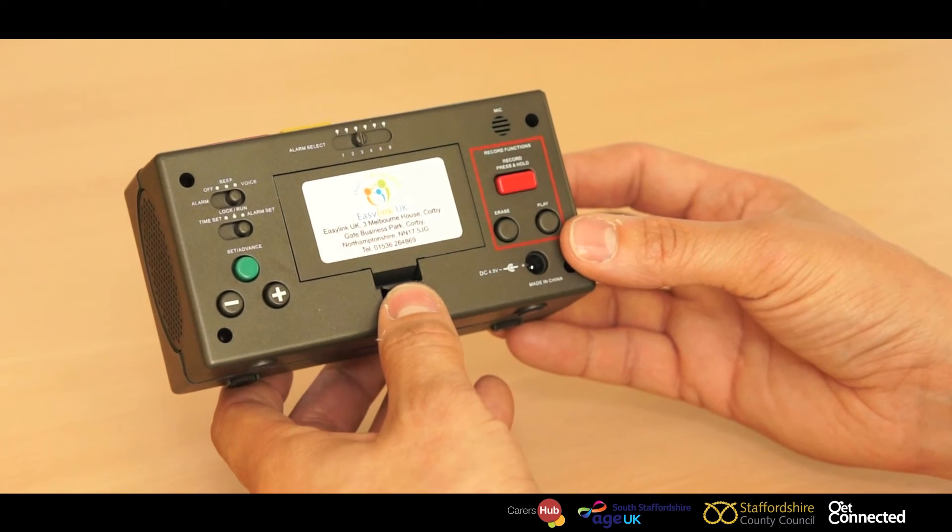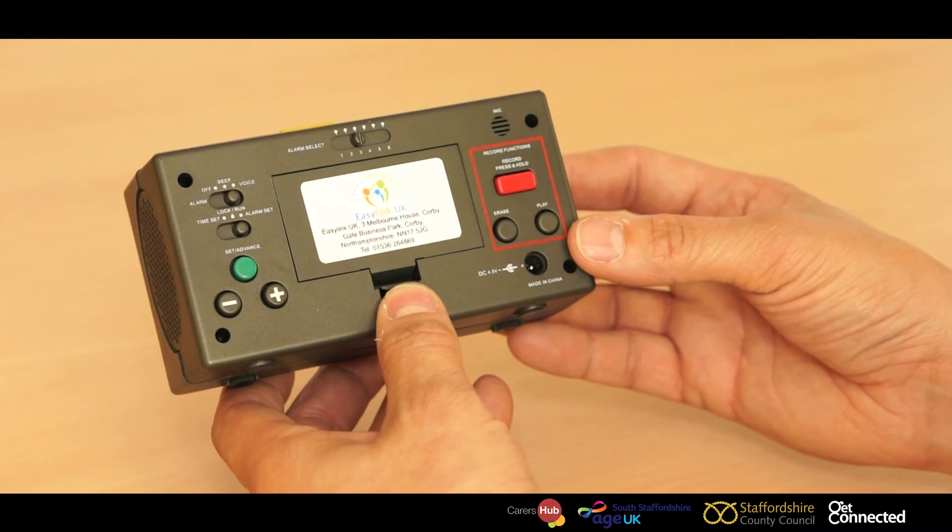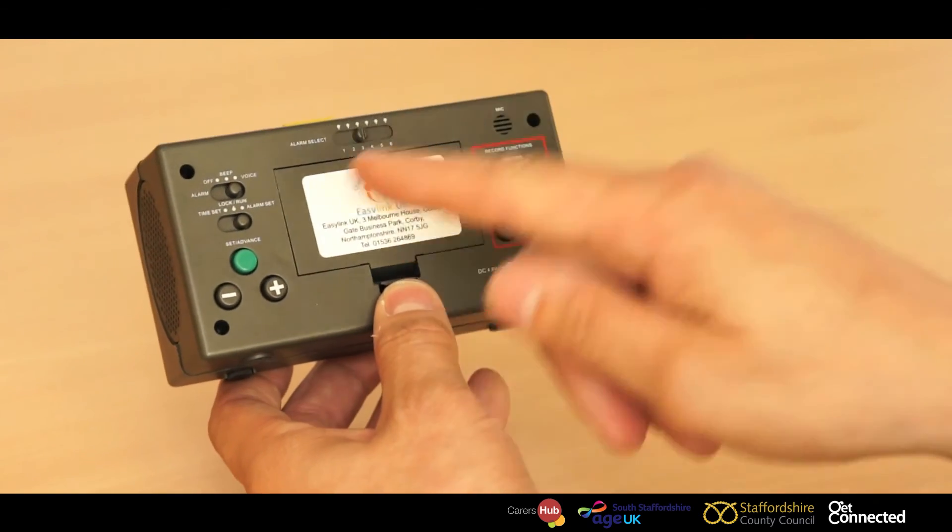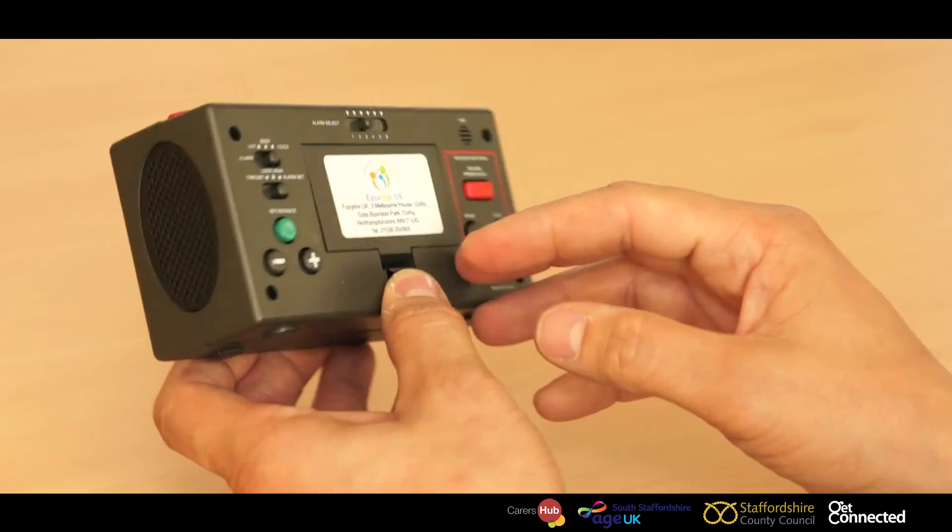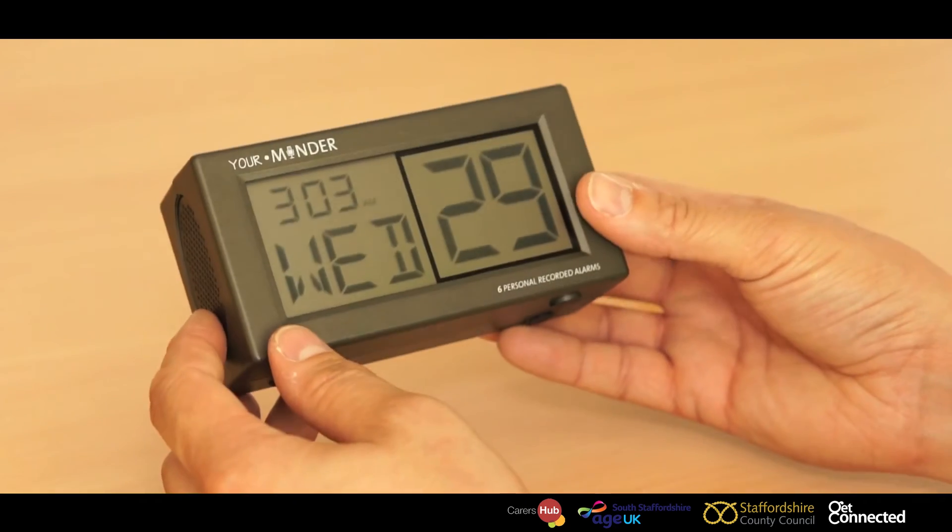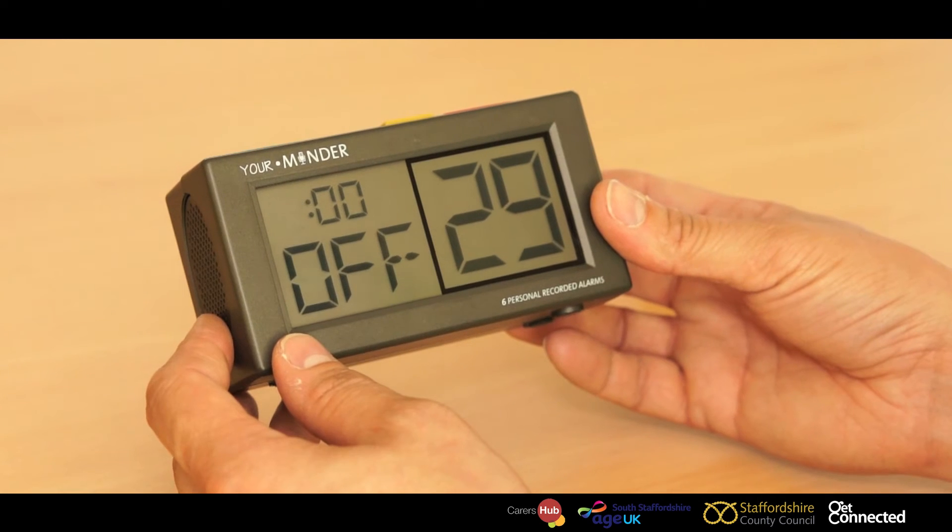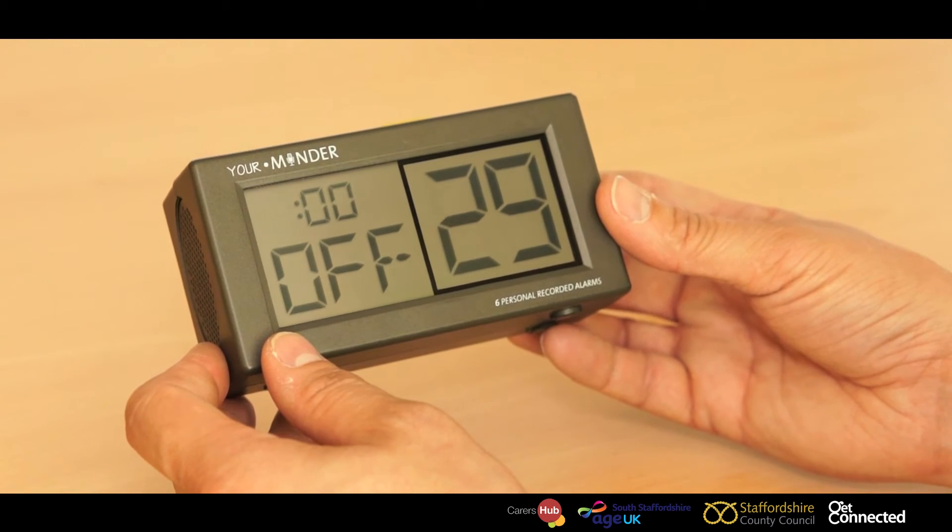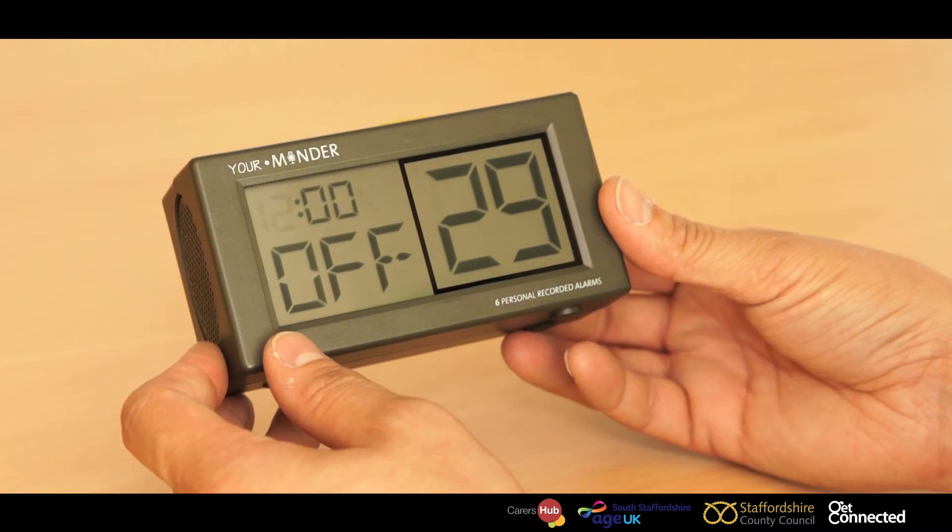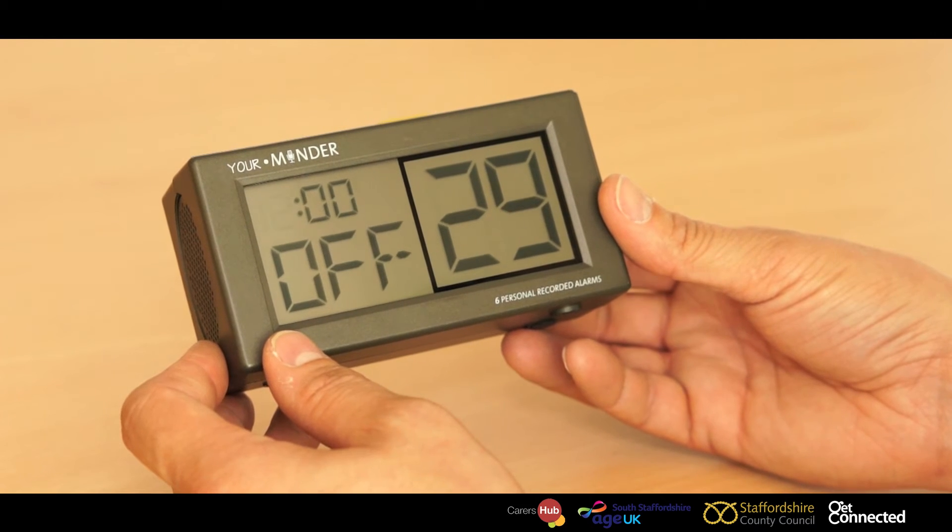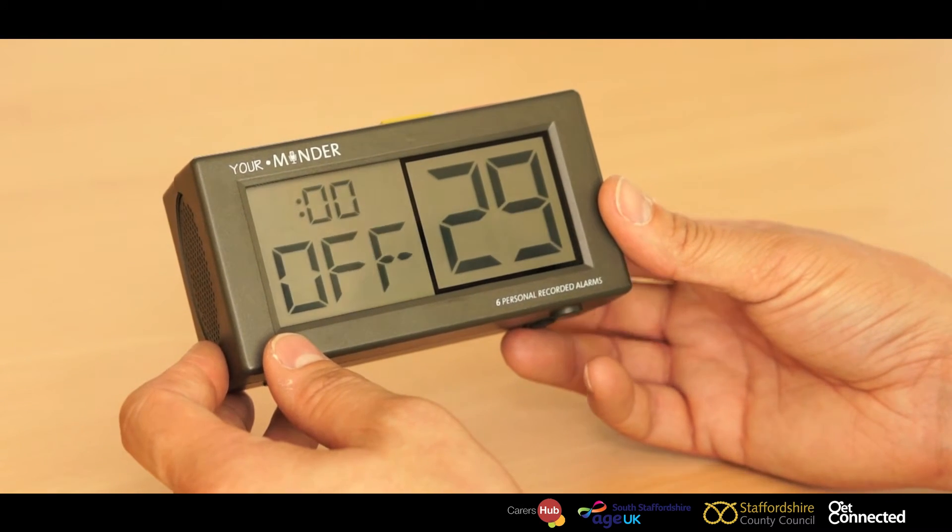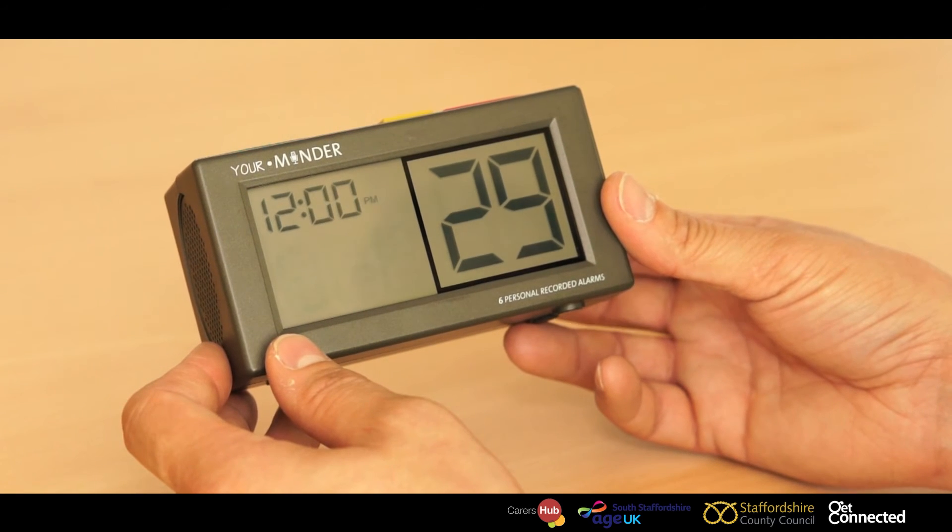So, we're now going to set an alarm to remind mum about that prompt. So, we've moved the switch to alarm set, spin the your minder around again and push the green set and advance button. Again, just using the set and advance button and the plus and minus, this will then advance through to set up the alarm.